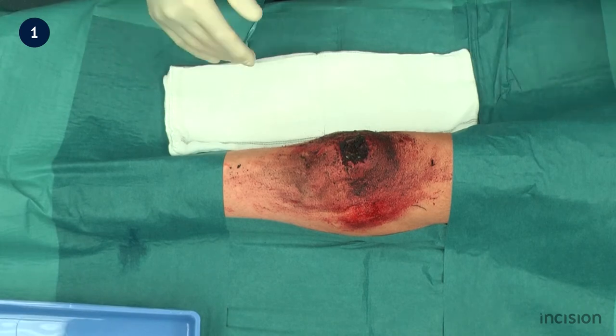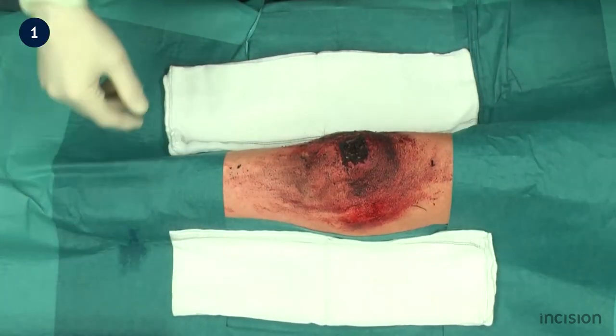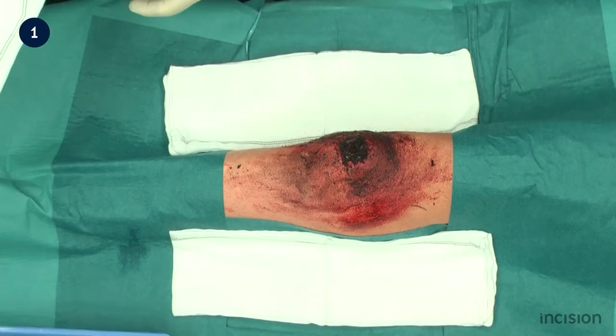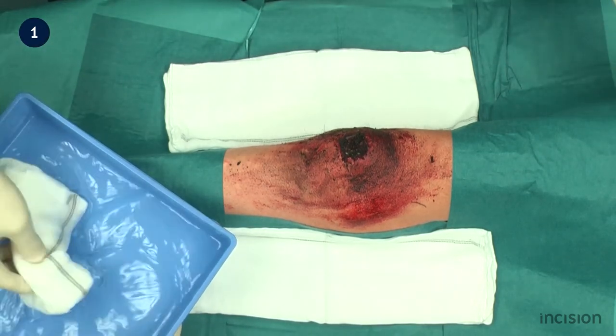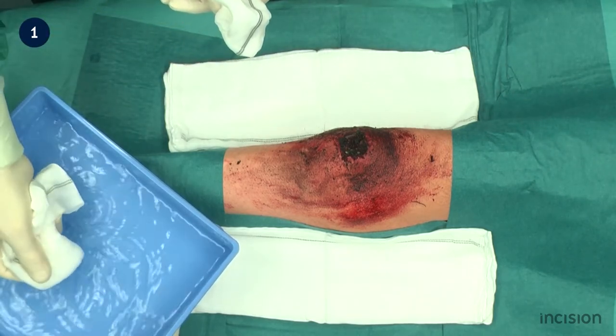The heavily contaminated wound is first cleaned using gauze soaked in normal saline solution. Gauzes are placed either side of, in this example the patient's knee, so as to avoid significantly soiling the drapes.